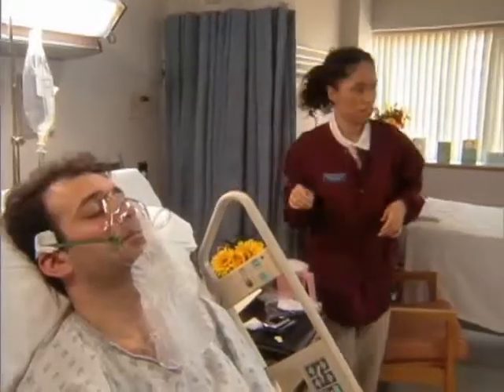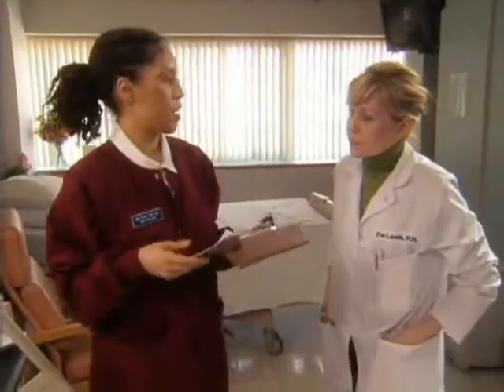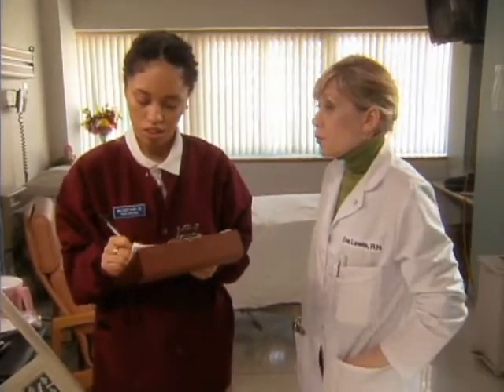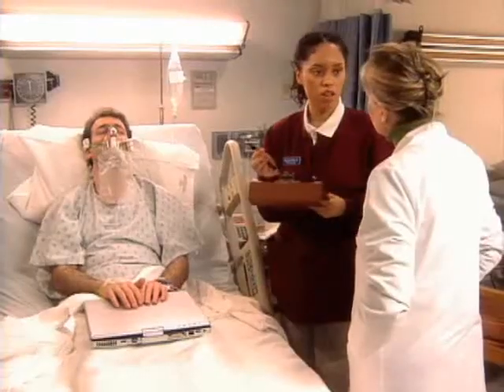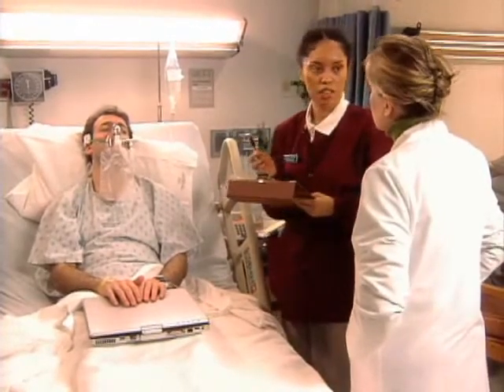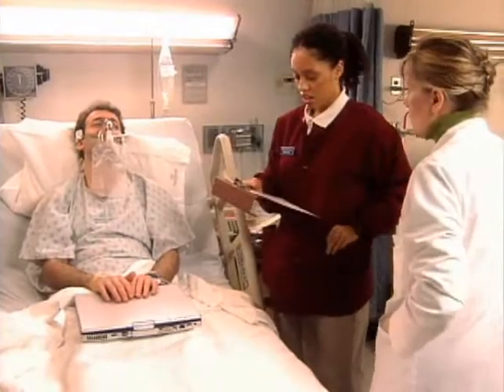Okay, everything looks great. So, right, I'll document, including my assessment, the type of mask used, liters per minute flow, and the patient's reaction to the procedure. Great. Now, skin integrity can be compromised due to moisture and pressure under the mask. So regular assessment of the area under the mask is an important part of care. Right, so I'll remove the face mask and dry the skin every 2 to 3 hours and check for any skin irritation. Good. And powder should never be used around the mask.